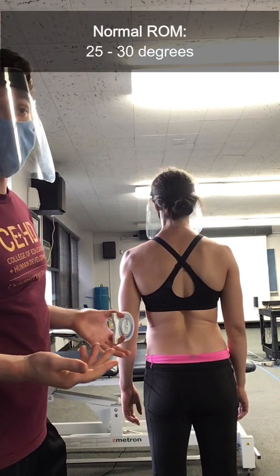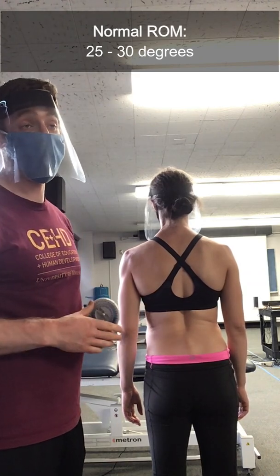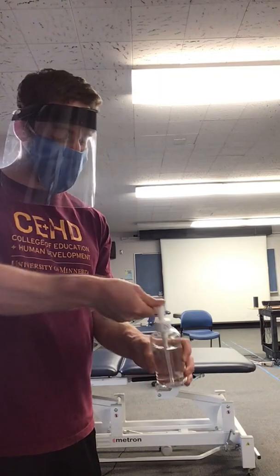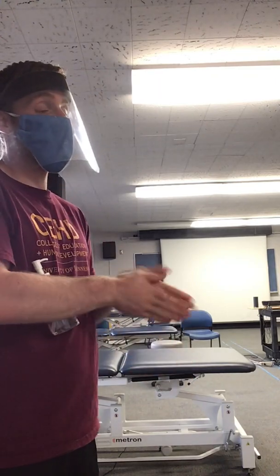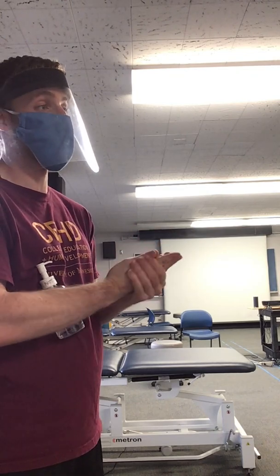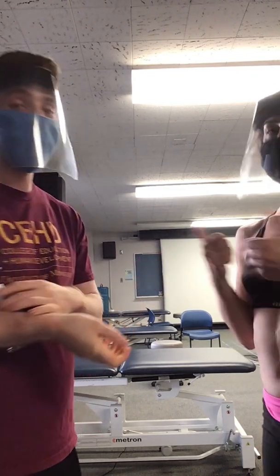The normal limit is 25 to 30 degrees, so she is within normal limits. All right, Jenna, everything is looking great. I'm happy to see that your spine is moving well, and we're going to get you some great strength training exercises to make you feel even better. Thank you.